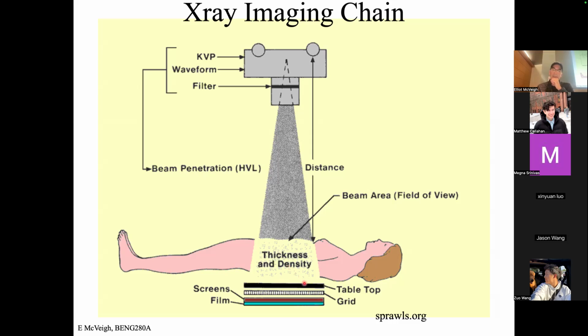At this angle, it can't get through the anti-scatter grid. It gets stopped. You make tiny little holes that look back at the target, so at any detector, I can only see the target through that one hole. Everything else is going to get absorbed.